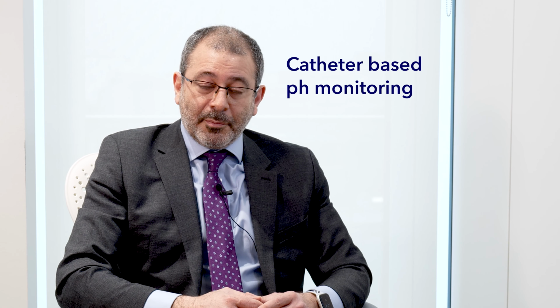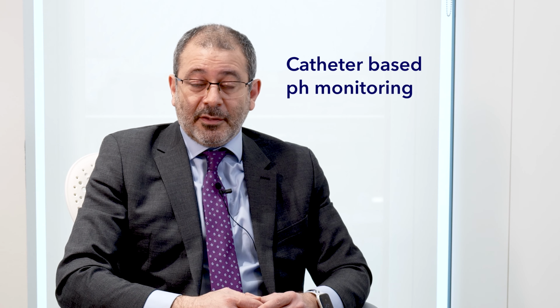But where patients have ongoing symptoms and they would like to be investigated further, and in particular if they're being considered for an anti-reflux procedure, then we tend to need to assess the frequency of reflux and the volume of reflux and what reflux events are leading to symptoms. So a reflux symptom association. We investigate this in one of two ways generally. Either we perform a catheter-based pH monitoring, which is the standard.